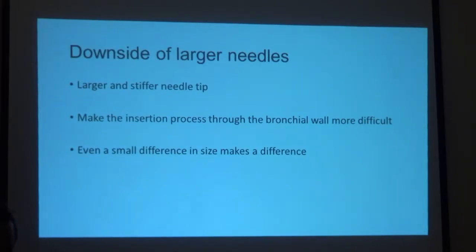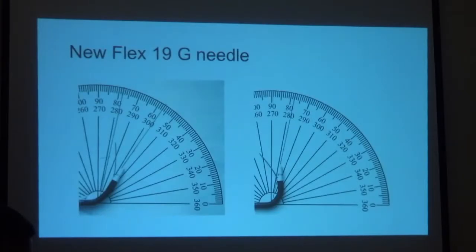Why bigger is not better? Because sometimes it's actually harder to puncture with a bigger needle. It makes a big difference. Even a small difference in size makes it harder to puncture. The needle is bigger and stiffer, and maybe that's what's impacting.